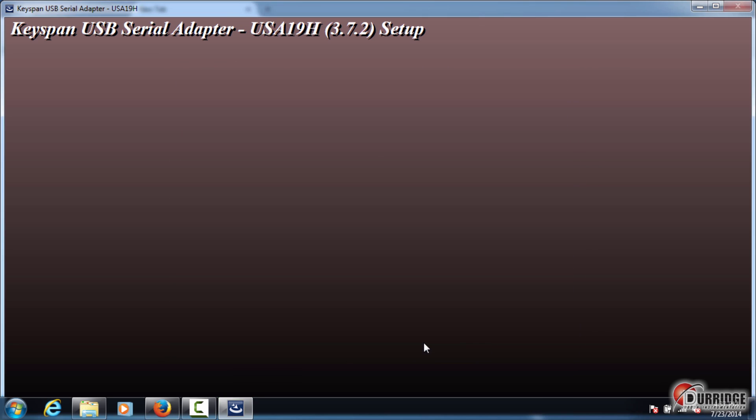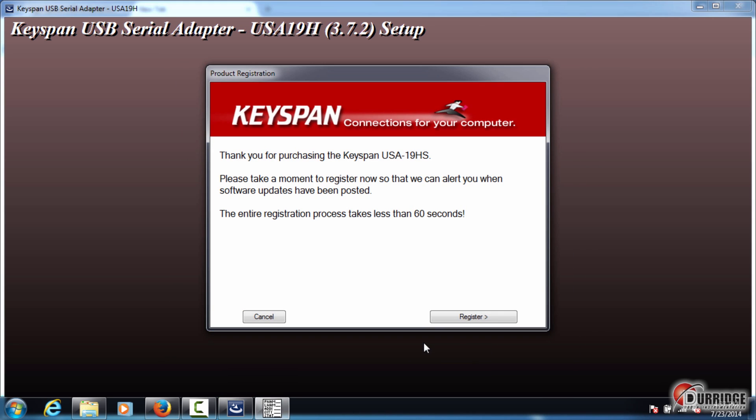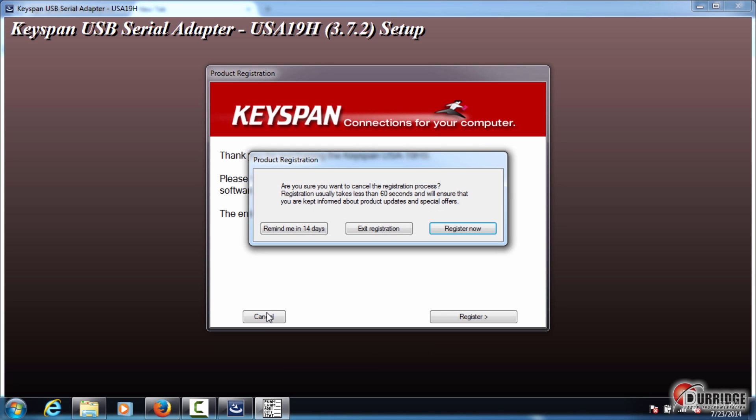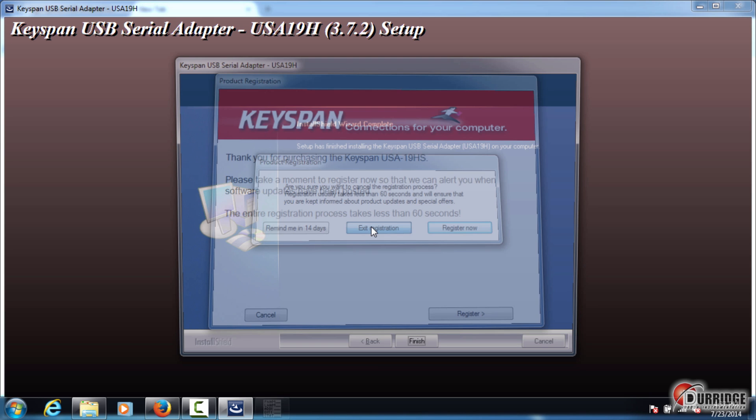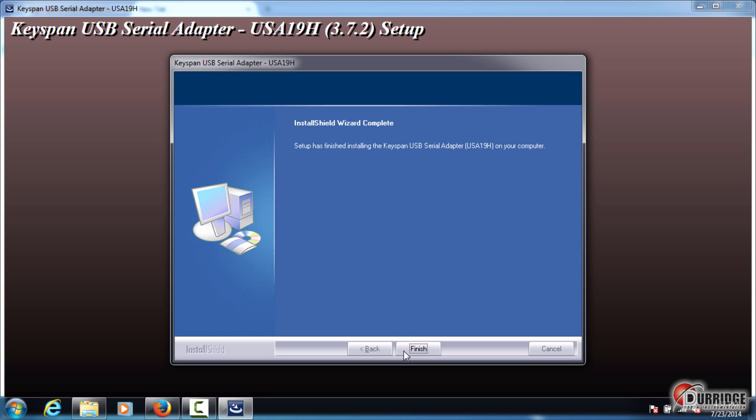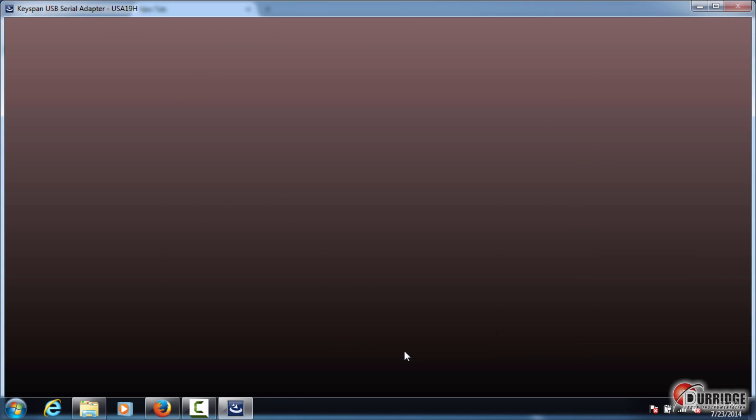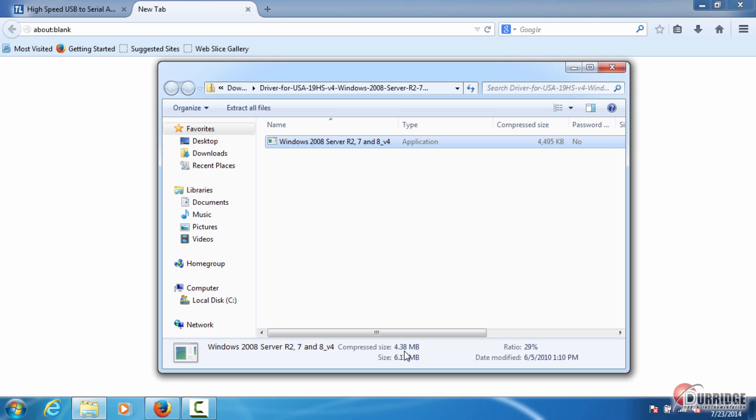A prompt for registration appears. Click Cancel, and then click Exit Registration. Click Finish. You have successfully installed the device driver for your Keyspan serial adapter.